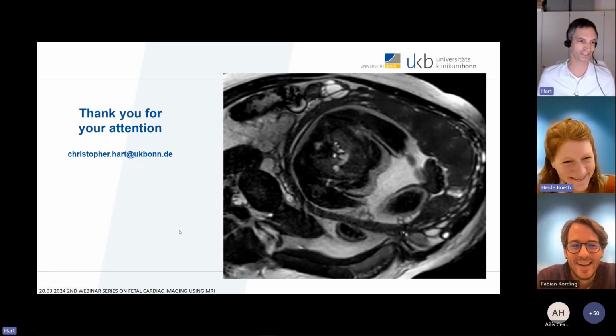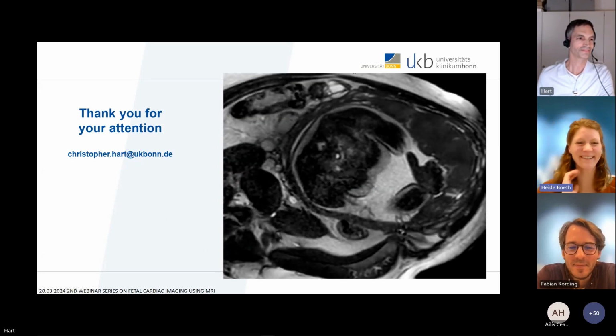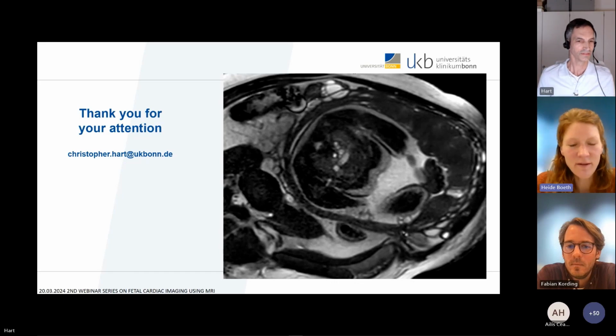Thanks a lot for your attention. Beautiful image. Yeah, thanks a lot, Chris. I would like to ask Chris, you have shown so very beautiful 4D flow images, and you have a really large number of fetal cardiac cases already scanned. How many of those cases do you perform fetal 4D flow successfully, and in how many of those cases is the result usable for clinical diagnosis? Can you comment on that?